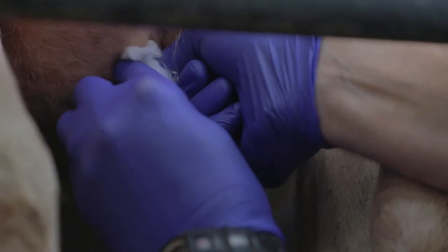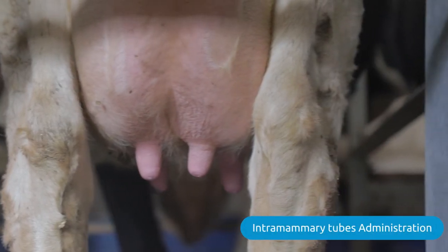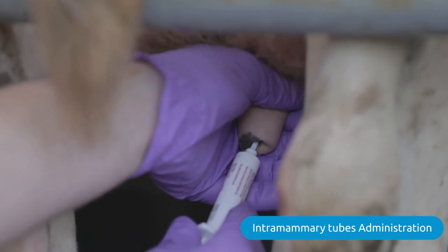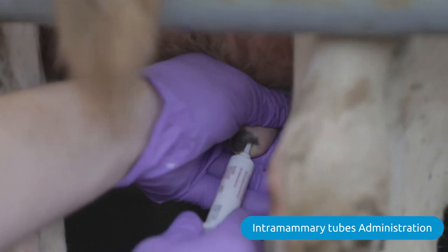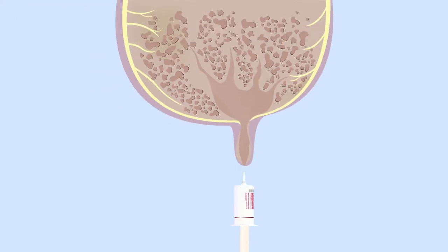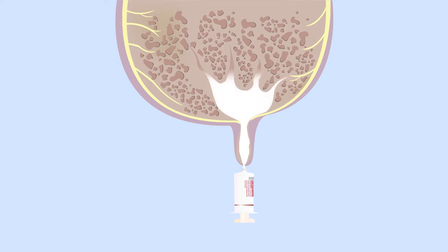What I'm now going to do is administer the dry cow therapy in reverse order. Now that the teats are clean, we can move on to administering the intramammary tubes. When administering antibiotic and sealant, you don't have to pinch the base of the teat — we're going to administer the whole of the antibiotic into the gland, then massage the gland after administering the antibiotic to ensure it's distributed throughout the gland.